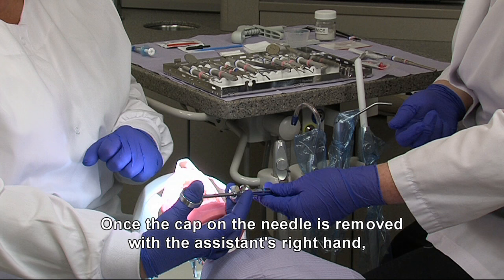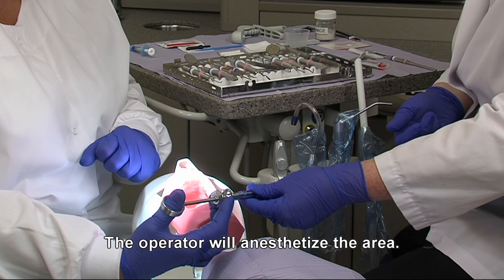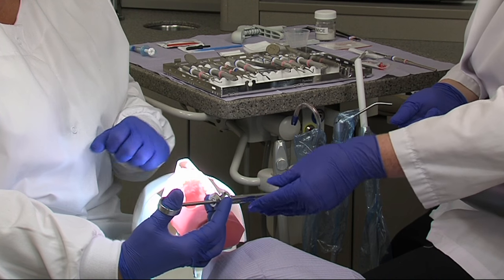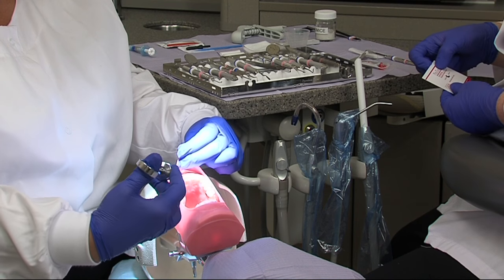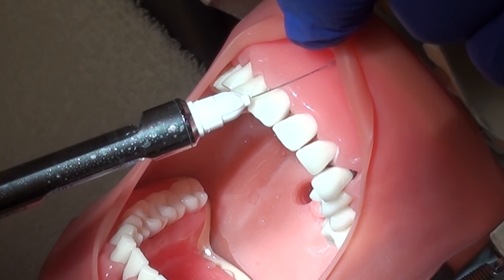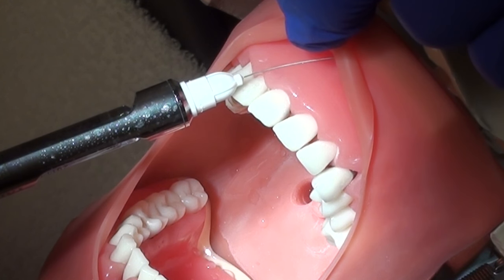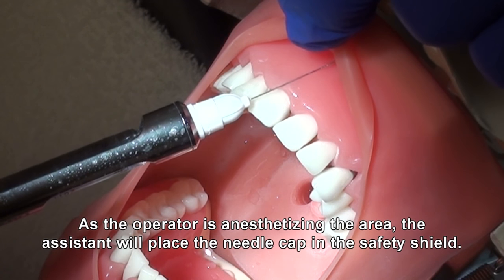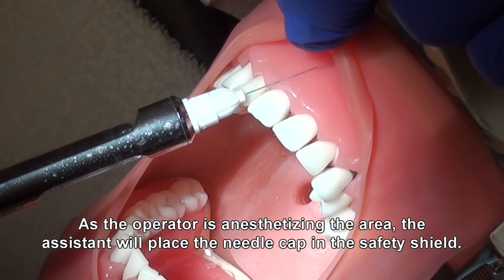Once the cap on the needle is removed with the assistant's right hand, the assistant will now use the left hand to turn the bevel of the needle towards the bone. The operator will anesthetize the area. As the operator is anesthetizing the area, the assistant will place the needle cap in the safety shield.